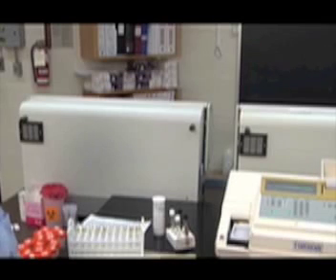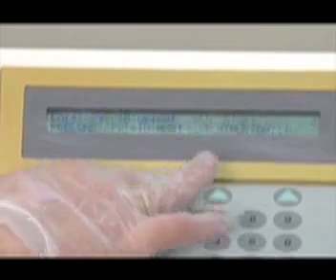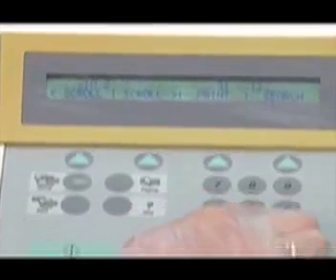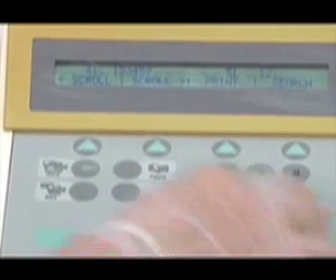The first step is to enter specimen identification for each patient sample. From the home screen, press ID, then preload, then enter the ID number, and press the Enter ID button. Continue programming patient samples until the list is complete and press Enter. Then press Start to begin sampling.